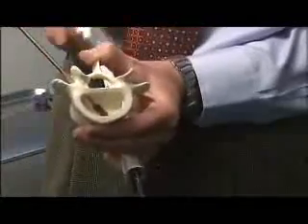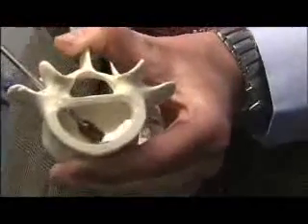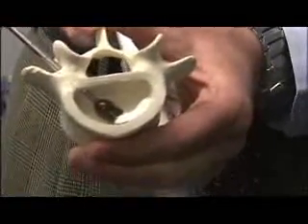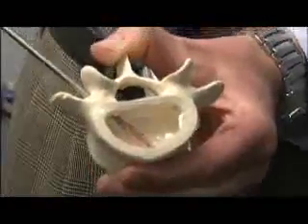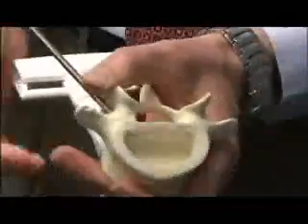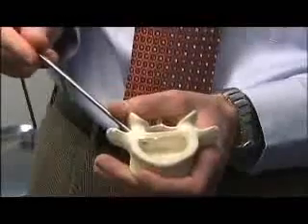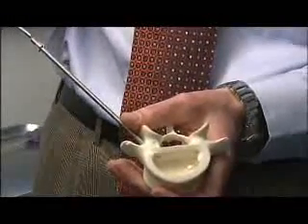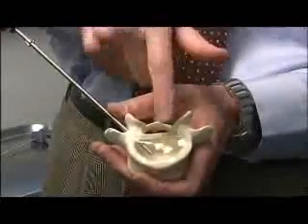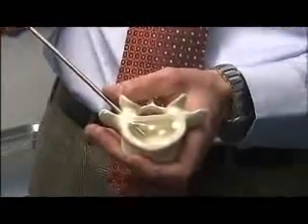And you can see as I twist this device, it leads to inflation of the balloon and a reduction of the vertebral fracture. Once the fracture is reduced, the balloon is deflated, and then the inflatable bone tamp is removed, and a bone filler device such as bone cement or other type of bone agent is placed through a cannula into the vertebral body and is filled within the cavity that has been created by the balloon device.